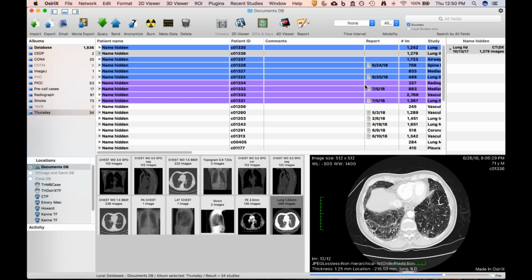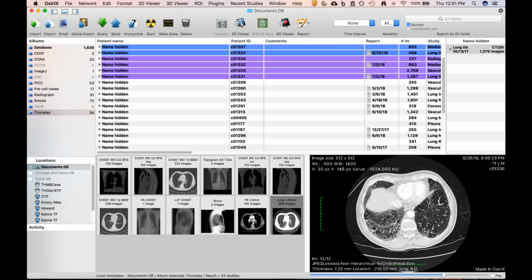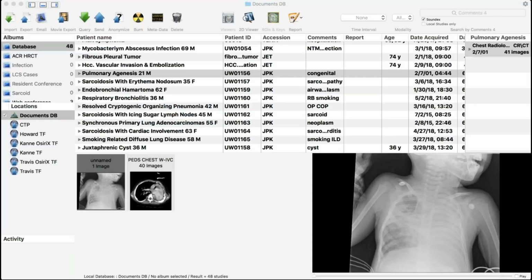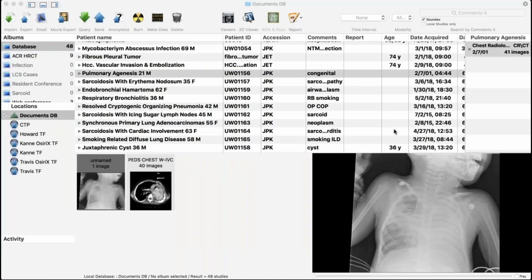Yeah. So, Jeff, if you can, I can prepare one more congenital case that I saw this morning. If you have something, or somebody else has something they can show for now. Let me take a peek here. I can have it ready in a minute. I just need to hide my screen. Yeah, I don't have anything else up right now. Well, I have something quick. I mean, it's just kind of a. Okay, if you want to take control, then I can get this other one teed up really quick, because it's an interesting one. Yeah, this is kind of just something. So let's see here. I'll show you the screen.